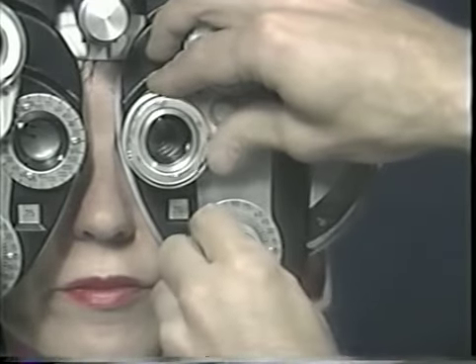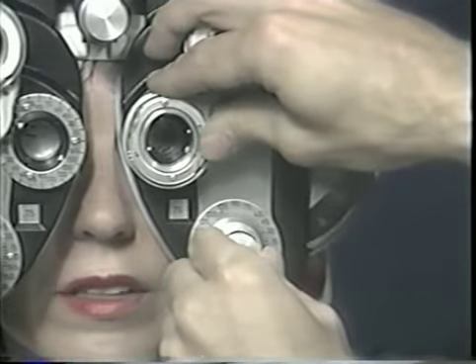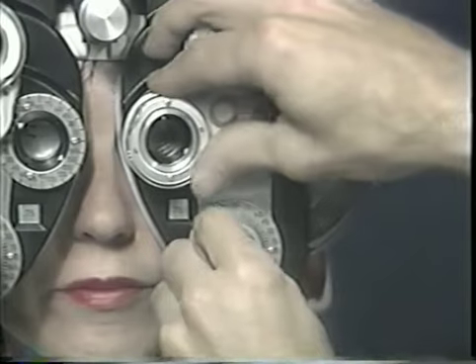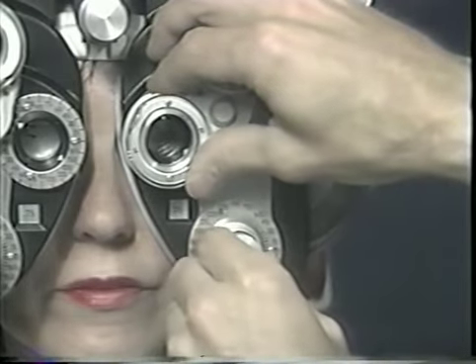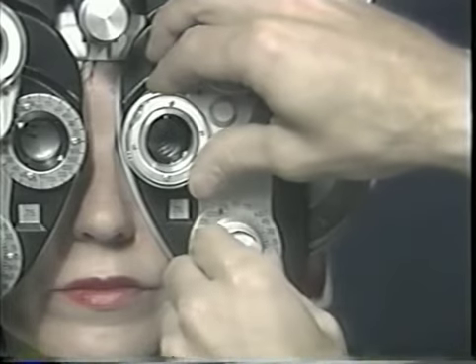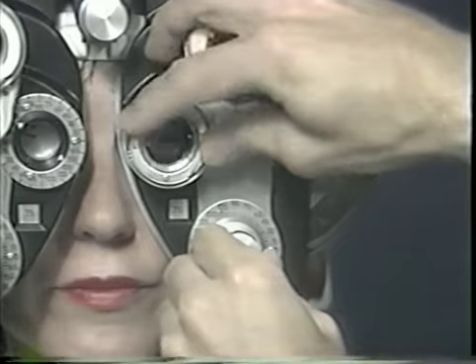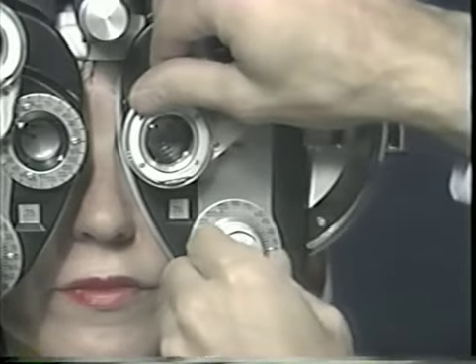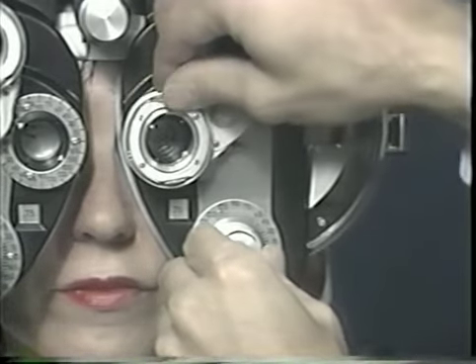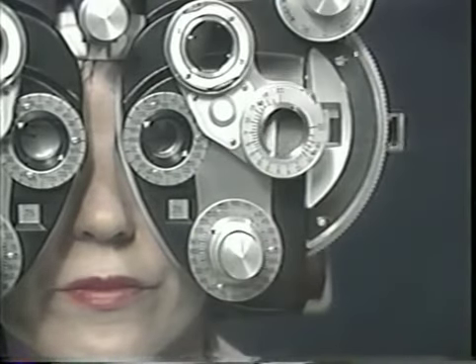3's better. Okay. 5 or 6? 5. Good. 1 or 2? 1. Good. 3 or 4? About the same. Good. Once again, which is better, 1 or 2, or about the same? About the same. Okay. How far down on the chart can you read now?